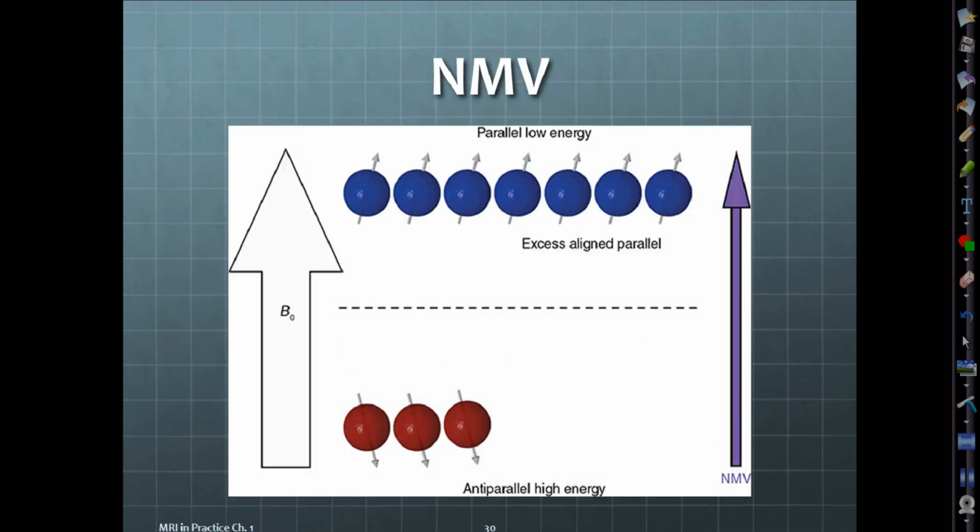But here's another representation of it. The excess of the parallel spin-ups. Here I'm trying to use different ways you describe it, parallel spin-ups, low energy, just so that you get used to it. The parallel spins, which are also low energy, the excess. You cancel out 3, I knock out 3, you have 4 left, and that creates your net magnetic vector.